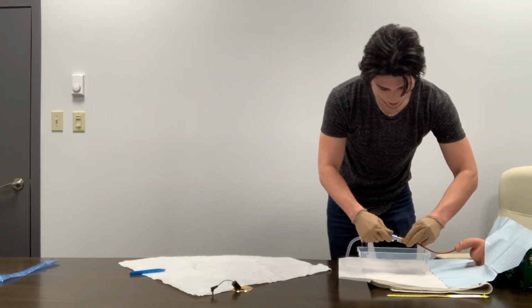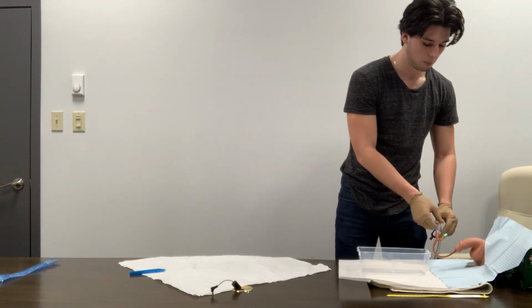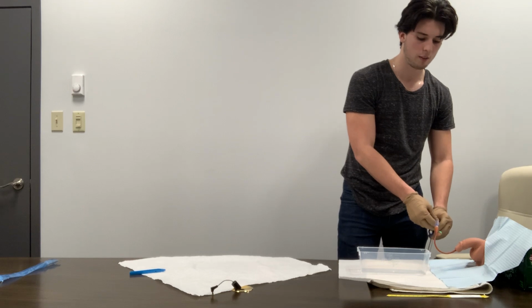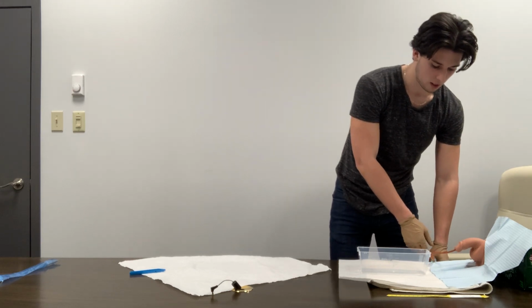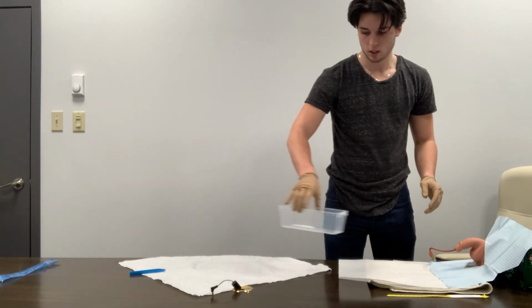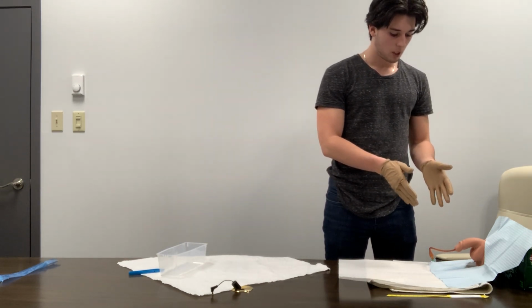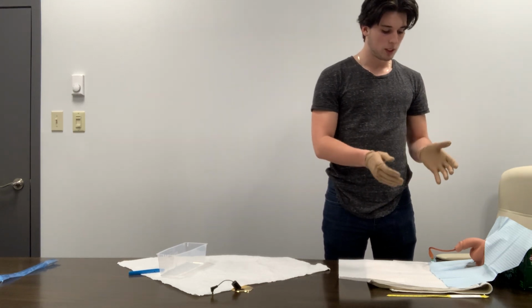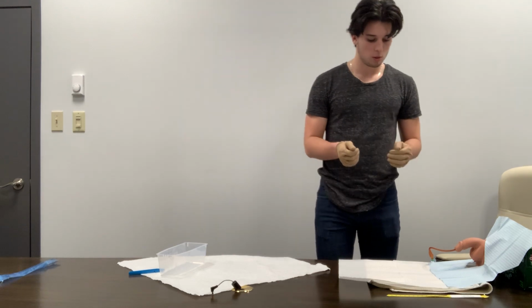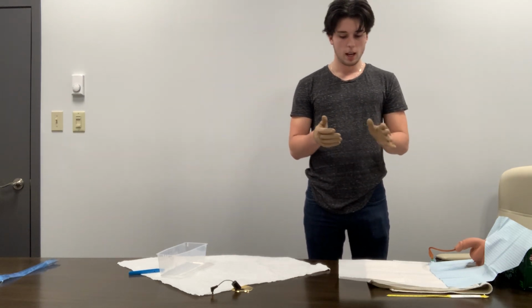So we will be throwing that in the garbage, and we will be connecting the two together. So once those are well connected, we will then attach this to the side of the patient's leg here, making sure that they have enough room as well so that they can move around a little bit. And then it's going to be attached to the side of the patient's leg, and we can go ahead and remove this. Now that it is completed like that, we're going to perform pericare. And once the pericare is done, we're going to clean up the patient here, and we're going to clean up our supplies.